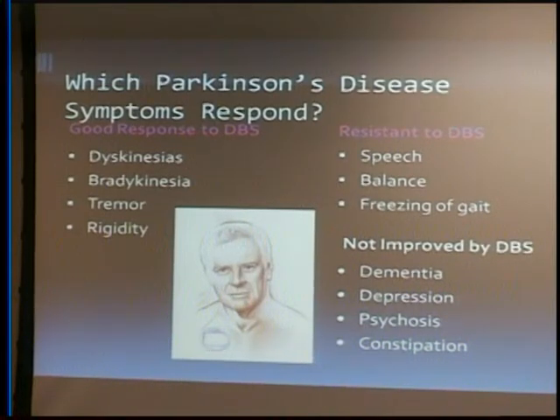I can tell you, having been involved with probably over 350 patients, I've seen instances where, yes, freezing gait does improve, or a person's falling a lot less in some people. And then I have other instances where patients say, I don't think it's helped my walking that much. So for some people, I think it can get better, but not for everyone. And I don't think we have good parameters or guidelines right now to say, who is it going to get better in? How can we know?